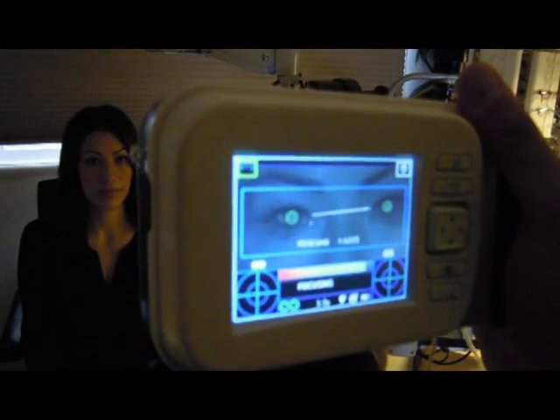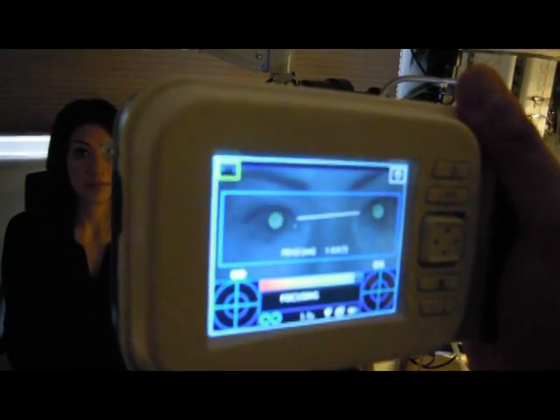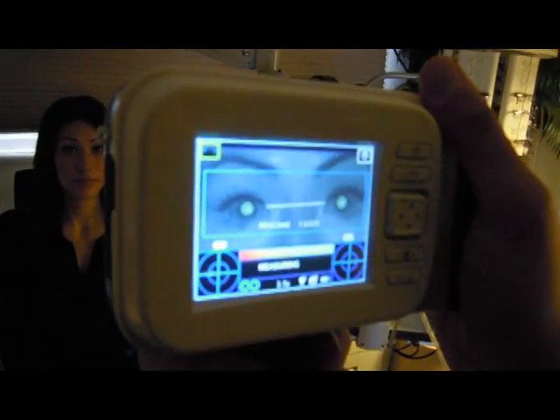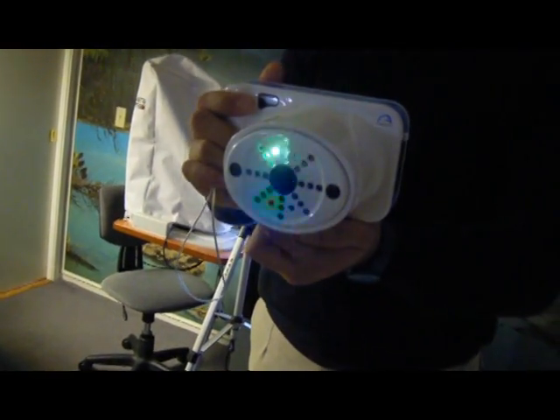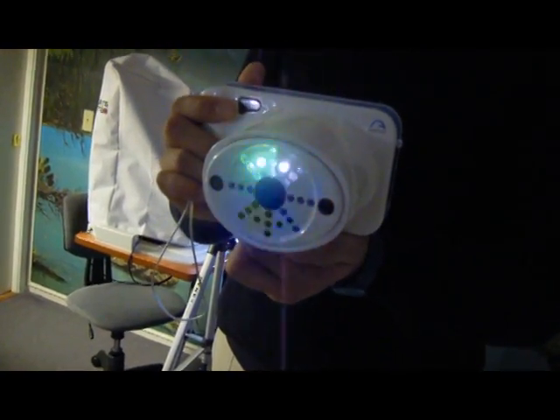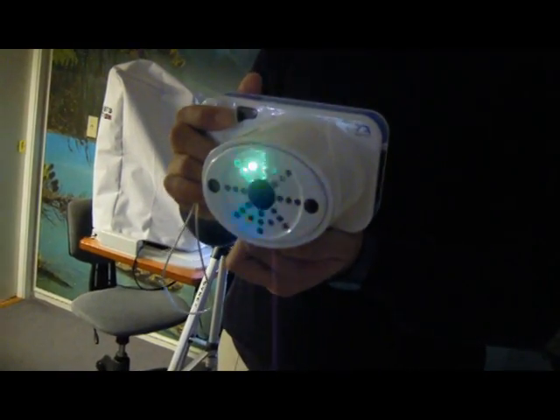A stable measurement distance of 1 meter is also important. Instruct the patient to keep his or her eyes wide open, clear of eyelids or eyelashes, and to look towards the center of the camera. Hold the 2-WIN horizontally with both hands, approximately at the same height of the patient's eyes, and at a distance of 1 meter.